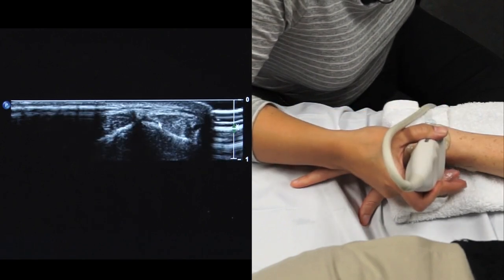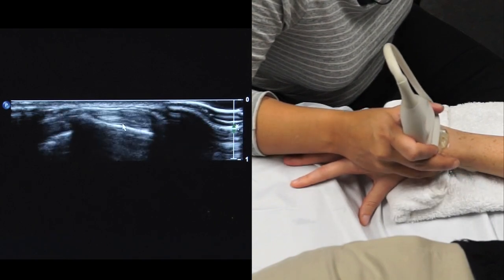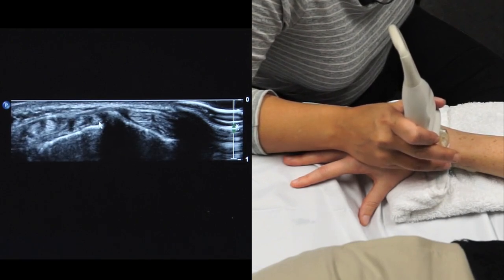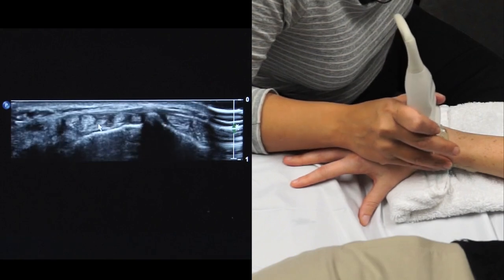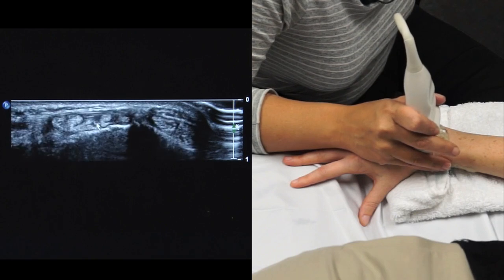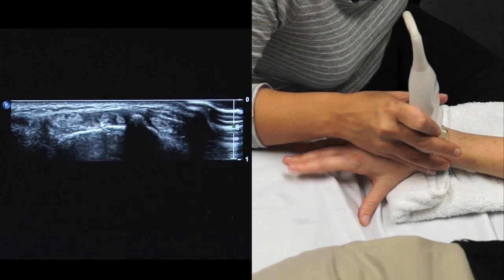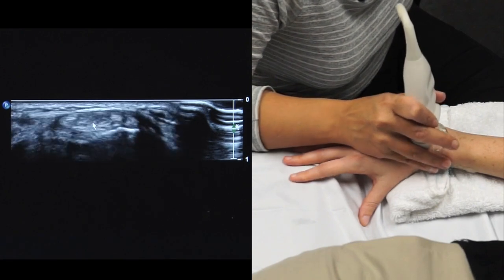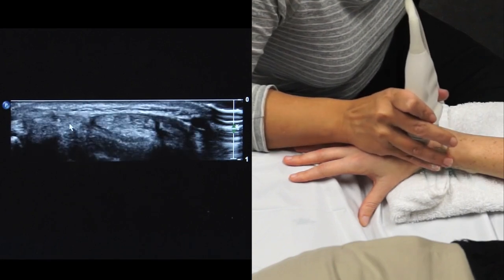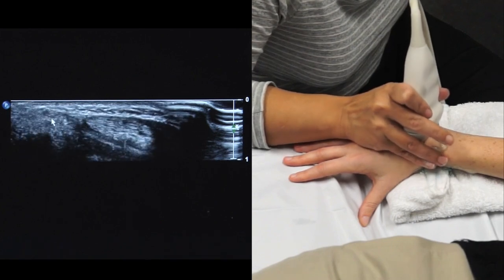So just in review, first compartment, second compartment, extensor carpi radialis tendons, longus and brevis, extensor pollicis longus, this is the third compartment, adjacent to Lister's tubercle. Then we have the fourth compartment, which are the extensor digitorum tendons and the extensor indicis, or the pointer finger. You can even have your patient wiggle their pointer finger or lift their pointer finger to see you're in that compartment. The fifth compartment is extensor digiti minimi, or the pinky. You can wiggle your pinky. See, that's the fifth compartment.